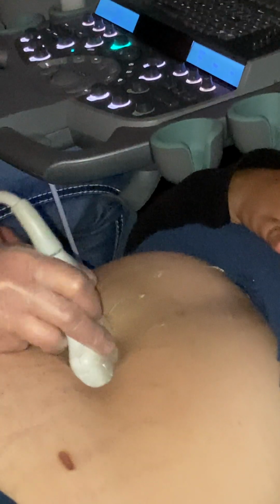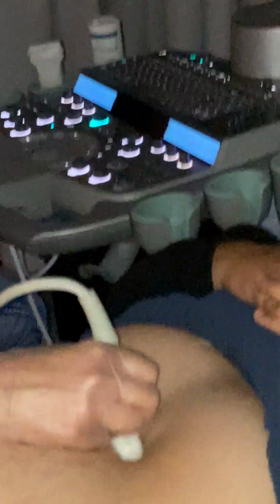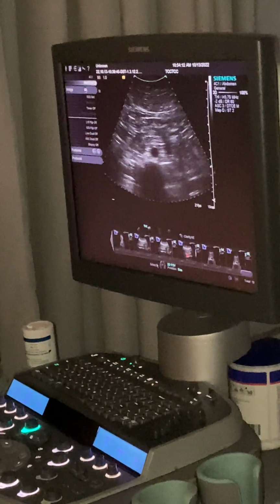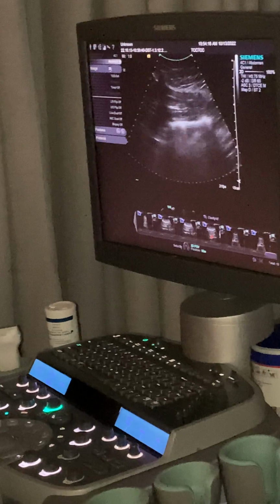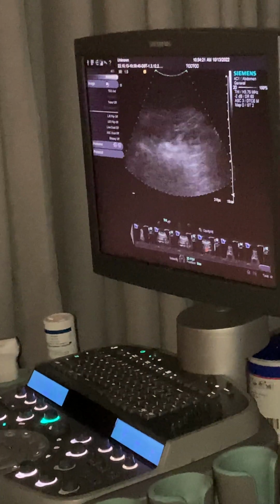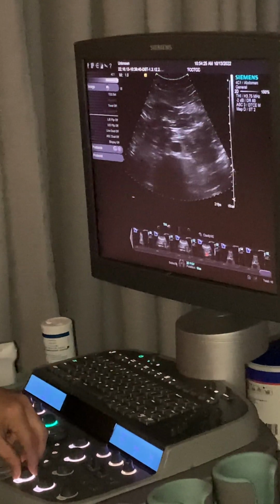So there's one way you can do iliacs to figure out who's left and who's right. And that is, we're going to slide down this distal, and then this is eventually going to bifurcate. So here he is, and I'm going to hit her belly button. We're going to kind of ignore that. Okay. So here we are at the aorta. Let's kind of get rid of some of our depth.